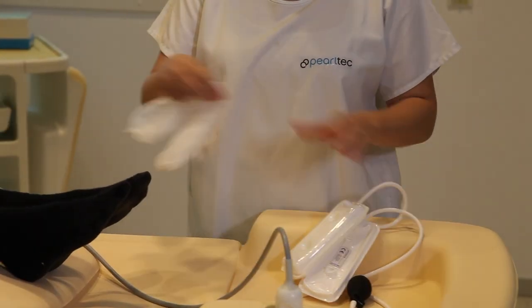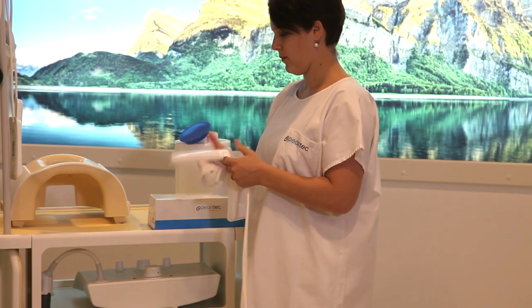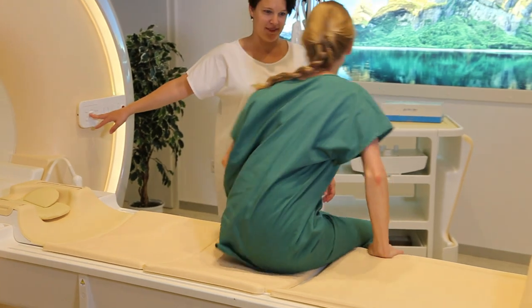Take off and dispose of the pad covers. Then wipe it down with any sanitizer and put it back on the rack. There's nothing else needed and you are now ready to proceed with the next examination.